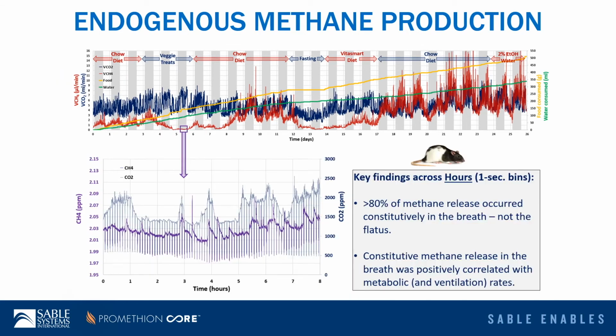So if we zoom into a specific 8-hour window during this real long 26-day recording, we can begin to see other patterns that have never been reported in literature. The most surprising of these is that the vast majority of the methane actually leaves the body in the breath, not the flatus. And we can see this in the purple trace at the bottom, where the raw methane levels are reported in parts per million.